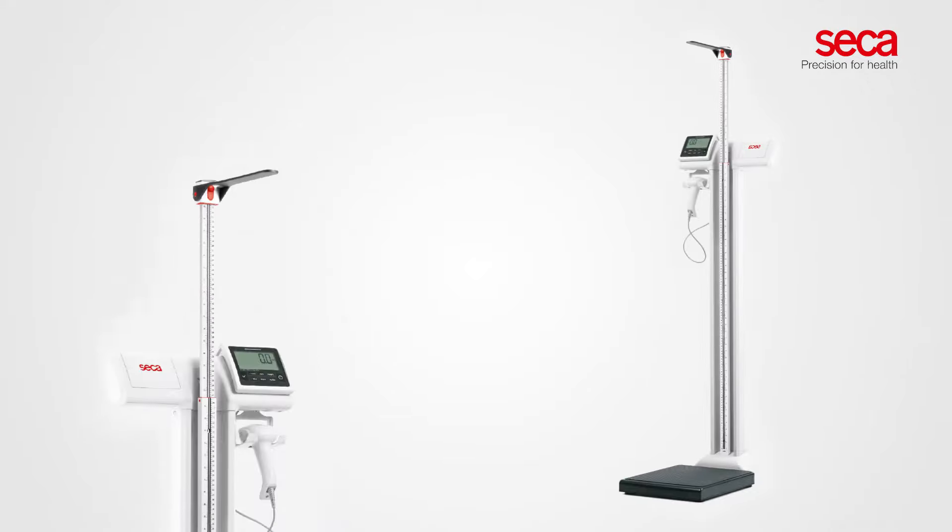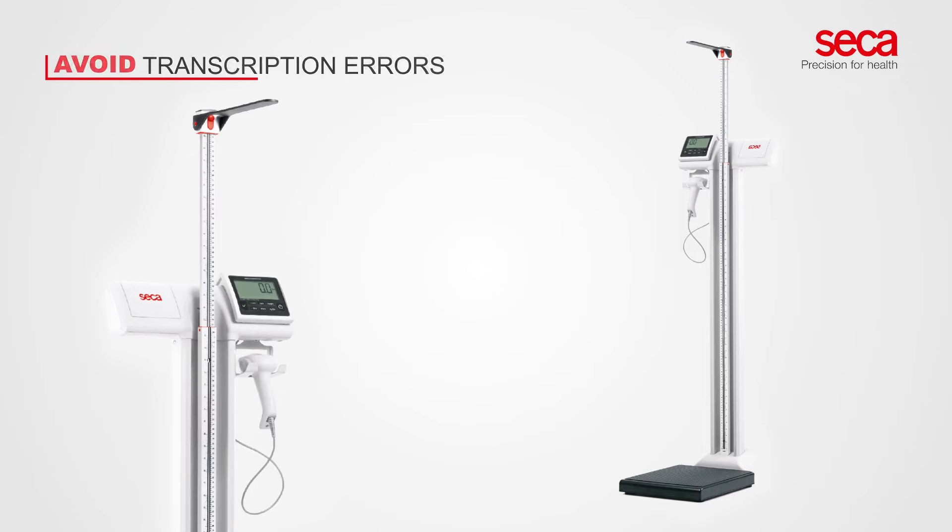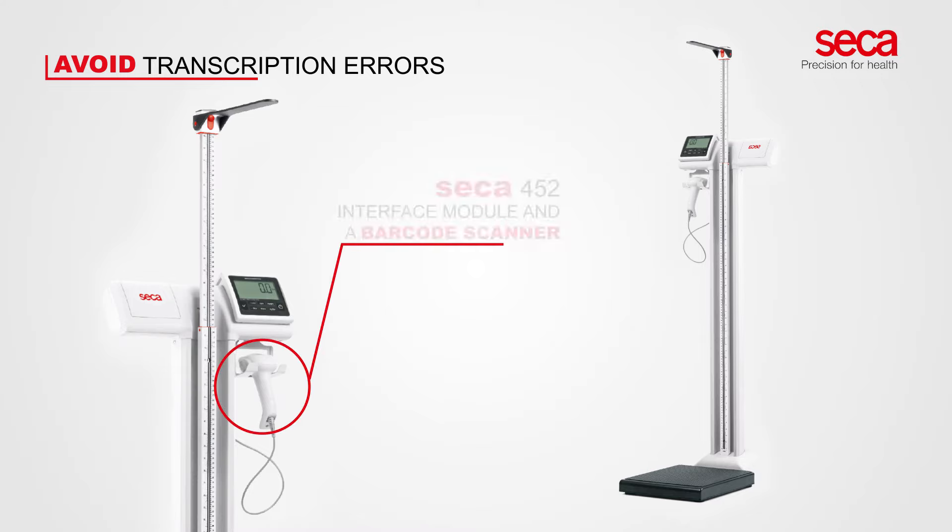To avoid transcription errors, the CECA 787 can be connected to any electronic medical record system when equipped with the optional CECA 452 interface module and a barcode scanner.